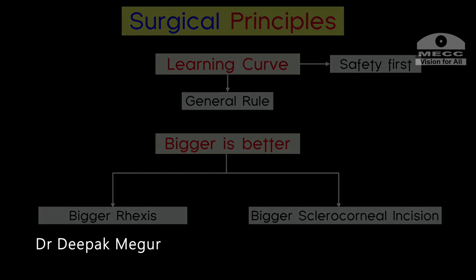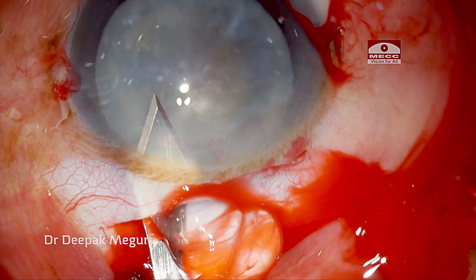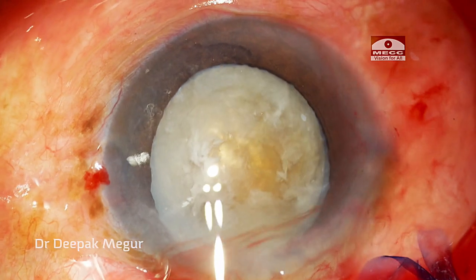Let us begin with this case. A large sclerocorneal tunnel is fashioned, approximately about 7 mm. A larger rhexis measuring 6 mm is created.